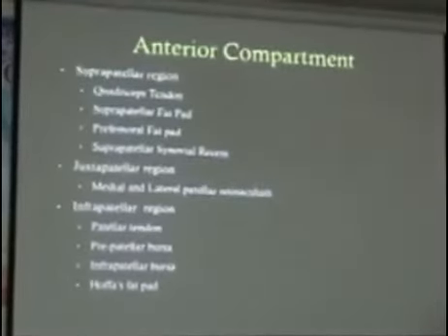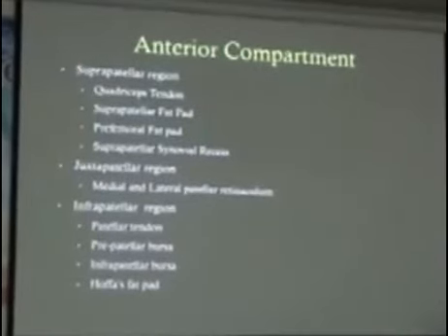So when looking at the knee, it's much easier just to break it down into compartments.